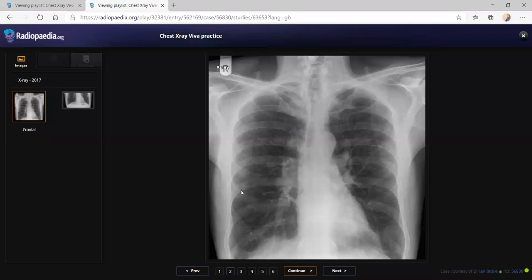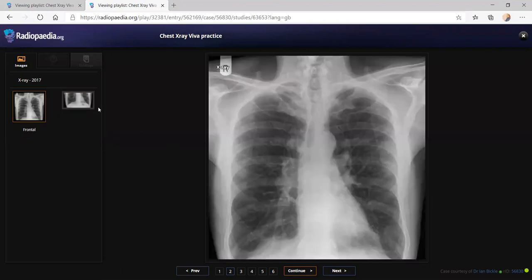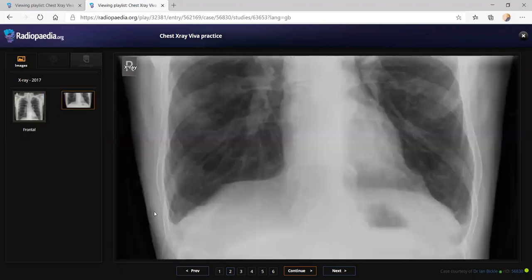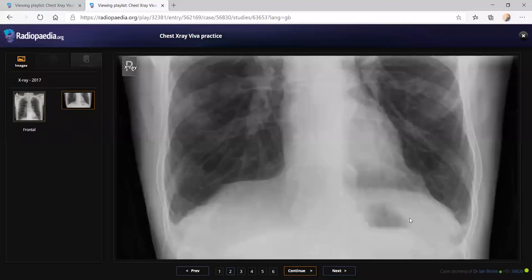I already told that it's a COPD patient, so you just say that the clinical history of COPD is evident in the film. Don't go on describing the COPD. Usually in COPD patients you will not see the entire chest in one film because it's elongated and hyperinflated. You will miss the CP angle usually, so you asked for that and I showed you the CP angle.